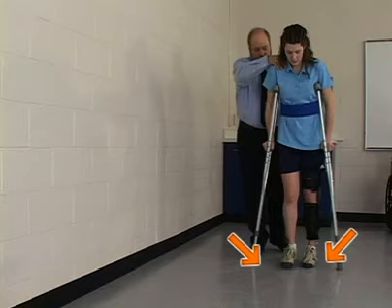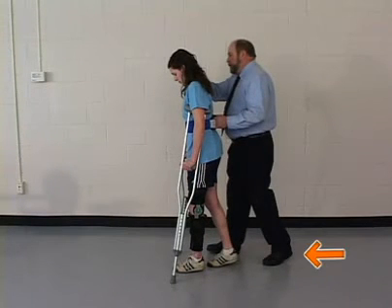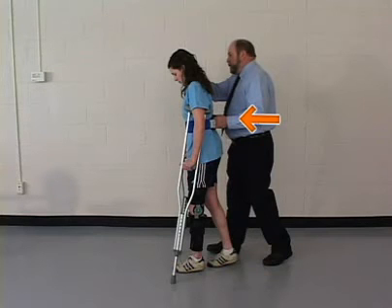Patients on crutches using a three-point gait pattern with partial to full weight-bearing capability start with their feet side by side in the same position used for determining crutch fit. The physical therapist must be positioned in stride behind and to one side of the patient. The therapist grasps the patient's gait belt and shoulder.